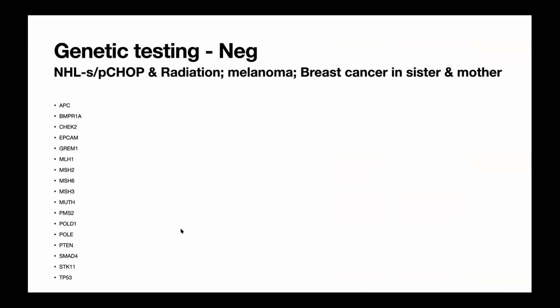So at this point, I wanted to just wait and maybe ask, we have two people, Sylvia and Selby, who have a lot of expertise in high-risk cancers. And I want their input into this case. What are your thoughts?